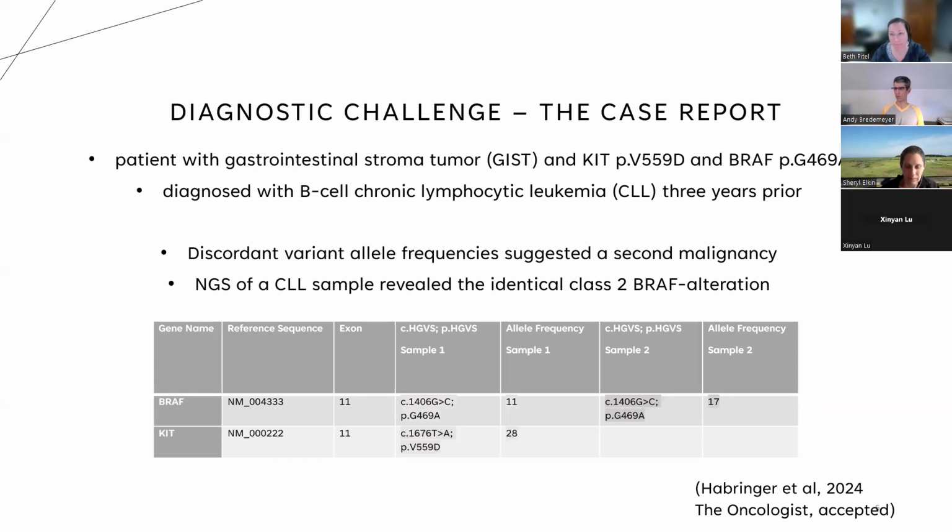Okay, yeah. So that's quite a bit faster. I mean, 2 weeks is really from first getting in the sample. Yeah, if we're getting a fresh sample that we still have to extract and go through our tissue slide review and things, it's quite a bit more. But if we're reflexing and we have DNA, it's ready to go in about a week. Okay, yeah. I would second that. Okay, that sounds similar then to our cases.